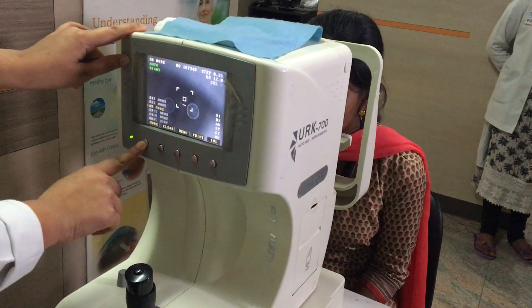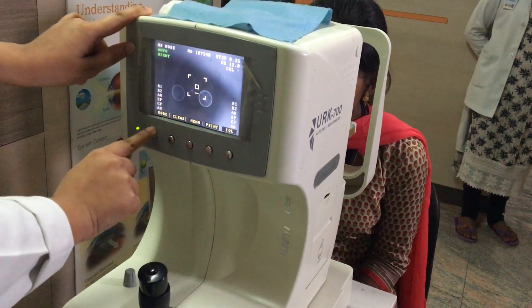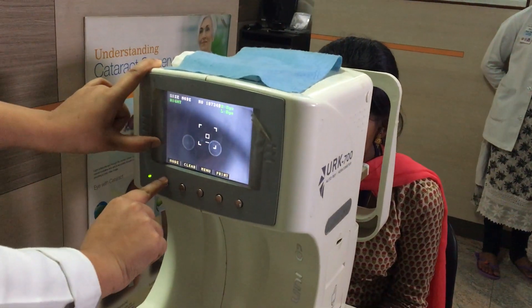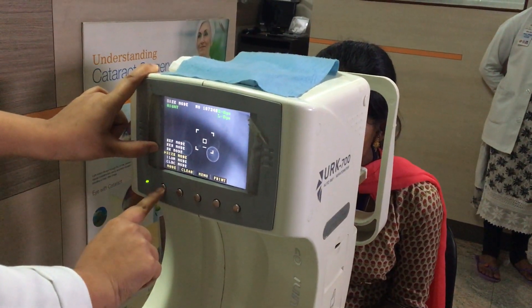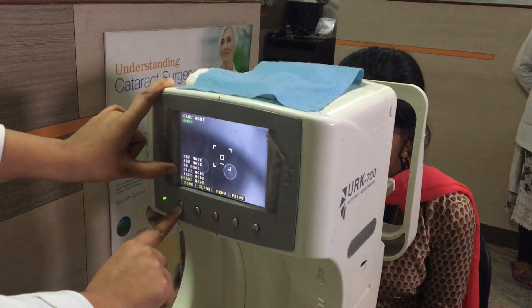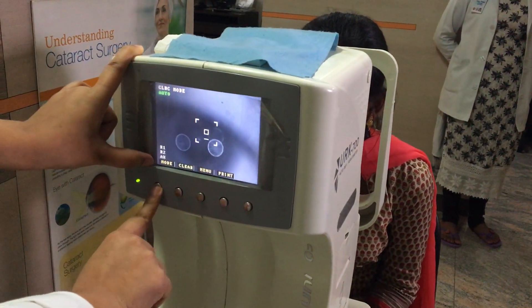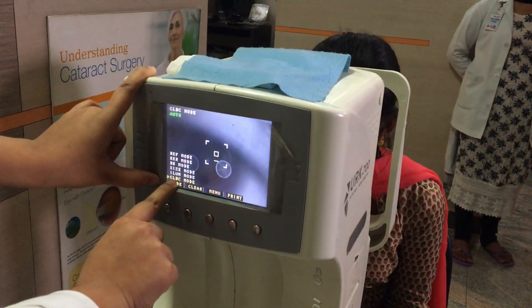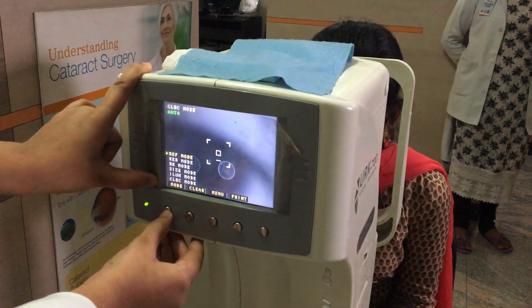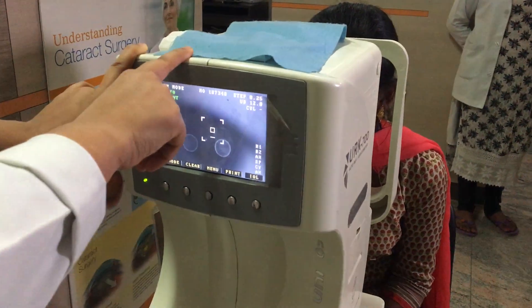Here are different modes. If we select the refraction mode, we can also select the keratometer mode and the contact lens size mode and illumination mode. Contact lens base curve measurement is called CLBC mode. For refraction, we will need refraction mode and keratometer mode.